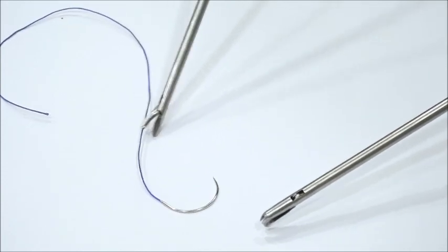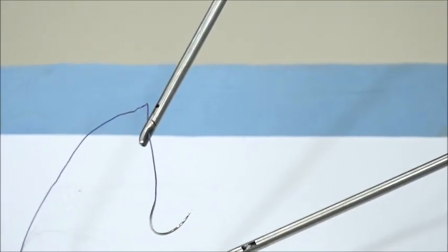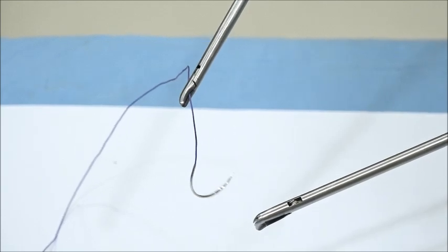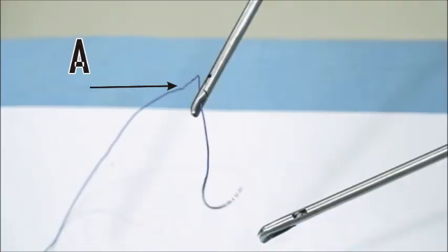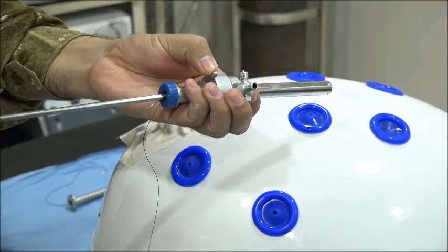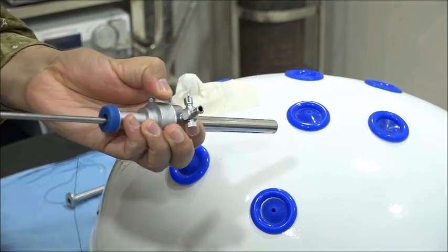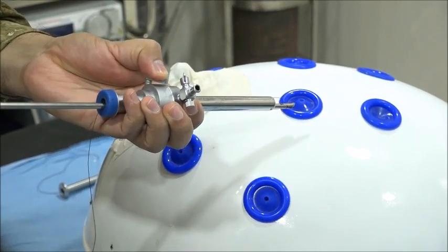While introducing the needle, we'll hang the needle 2 centimeters distal to the base—that is point A. If a 10 mm trocar is available with the help of a reducer, we'll first insert the needle inside, as I have shown in the figure. We'll insert it in the abdomen.